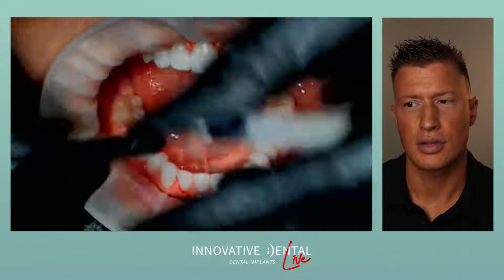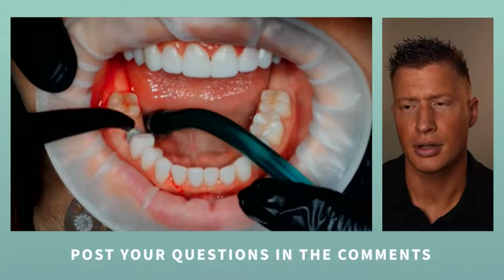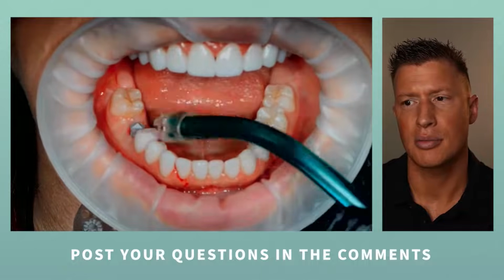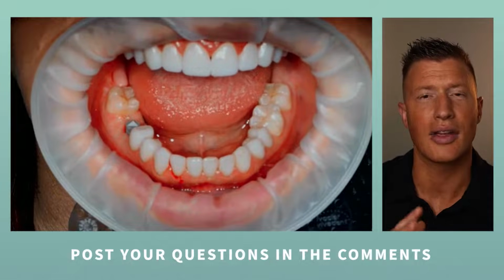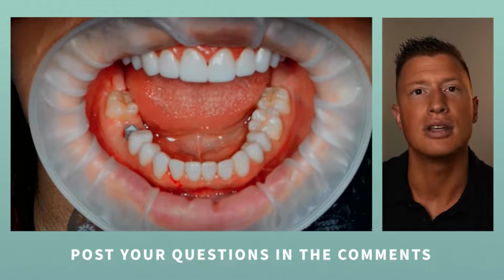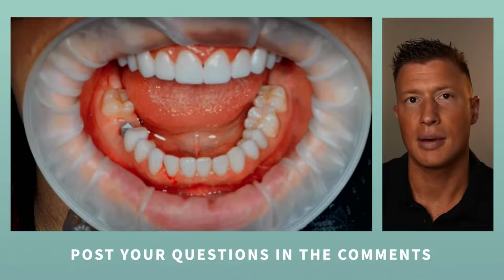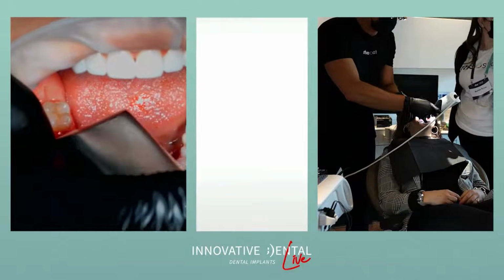And then we're going to take a digital scan. So it's going to be with our CEREC machine. We're going to wand over the tooth or over that scan body, and that triangle that's on top of it is going to tell our software exactly how that implant is placed relative to our other teeth. So that way we can design an implant crown and get it properly set up within her bite.